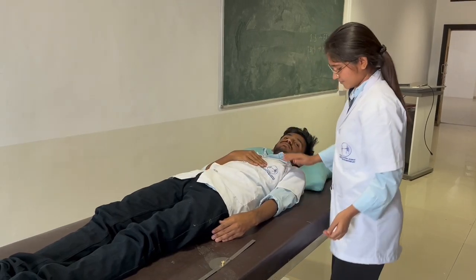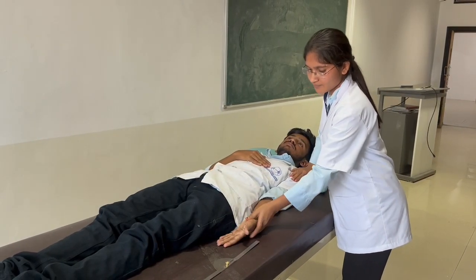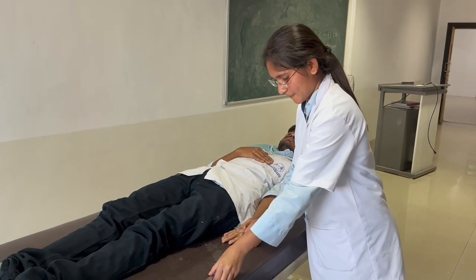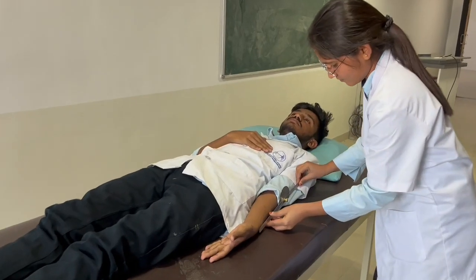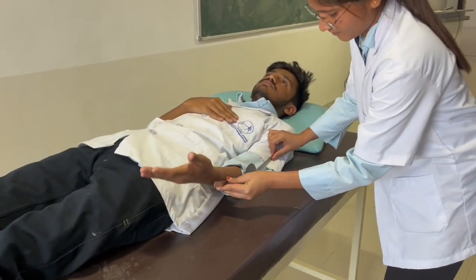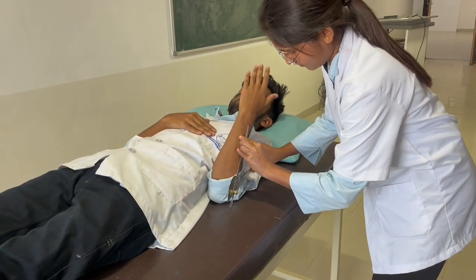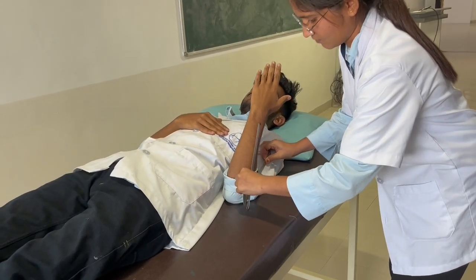The subject is in supine position. The shoulder is at zero degree flexion, extension, and abduction/adduction, with the palm facing towards the ceiling. Stabilization is at the humerus. The fulcrum will be placed at the lateral epicondyle of the humerus. The stable arm will be parallel to the humerus, and the movable arm will be parallel to the radius.